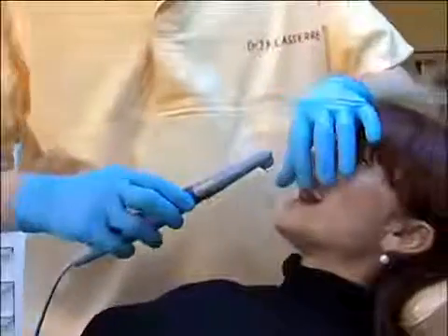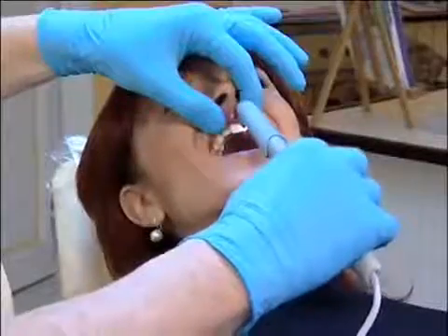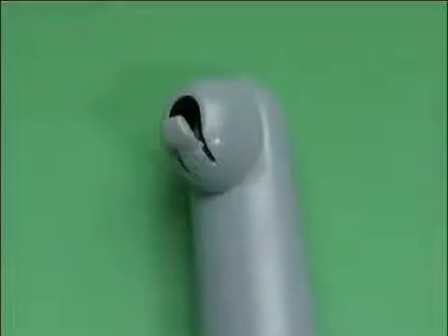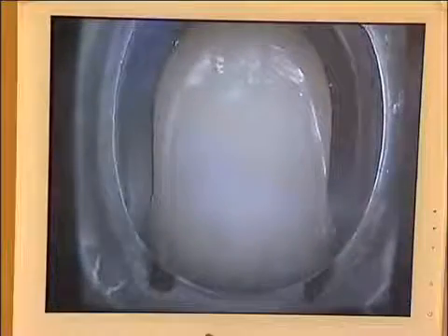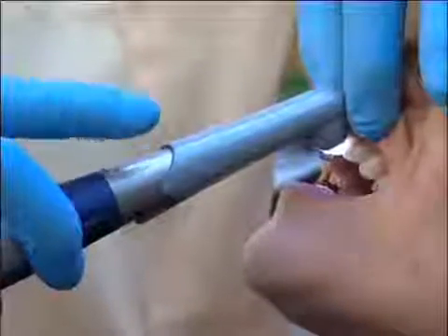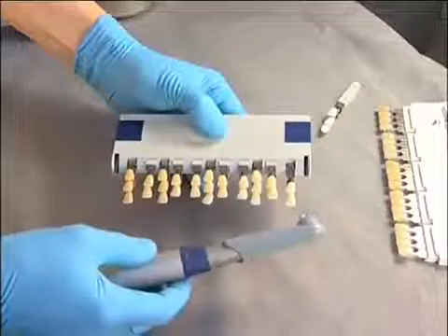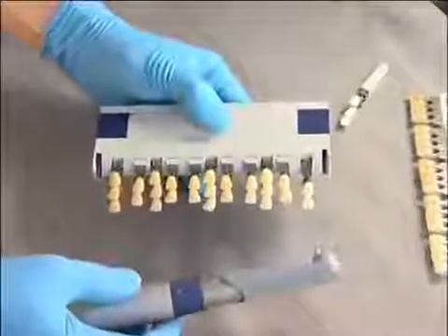The first step consists in putting that tip parallel to the tooth surface, making sure that the tooth's incisal edge fits in the special stabilization notch. When the positioning is correct and controlled on the screen, the finger will press the Sopro touch to freeze the left half side of the reference image of the tooth. Here is a color chart working with a priority of luminosity, then of saturation, and lastly of tint.